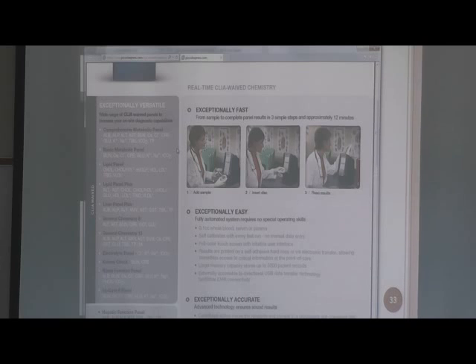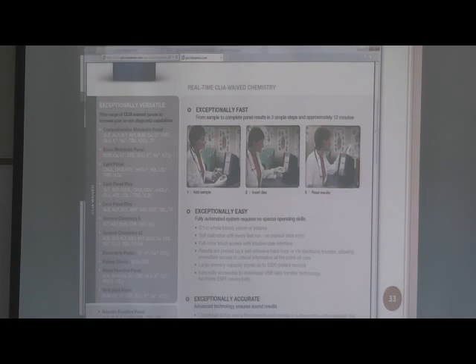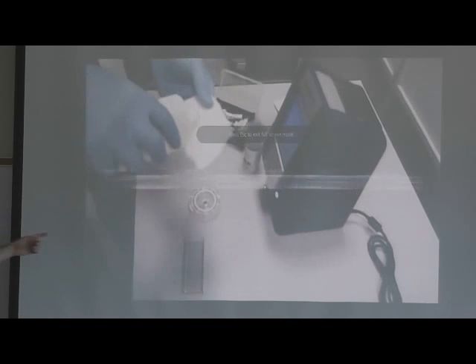I should know. But you can do basic metabolic panel, lipid panels, lipid panel plus, liver panels, general chemistry 6, general chemistry 13, all these different things, all on one little disc, which is pretty cool. Yeah, well, they're expensive to do, but then you could do it right there and you get your results. So this is an example of doing it.